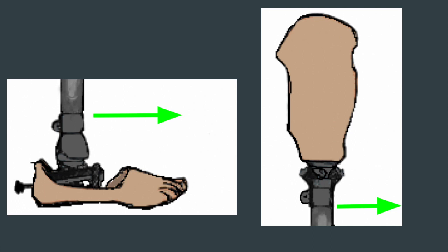The prosthetic needs to be fit correctly in order to withstand high internal loads. There are three types of internal loads in 2D cases: normal forces, shear forces, and bending moments. Normal forces act perpendicular to the surface, as shown by the green arrow. Shear forces are along the surface, as shown by the red arrow. And the bending moment is the torque applied to both sides of the prosthetic as if they were cut in two, as shown by the curved dark green arrow.